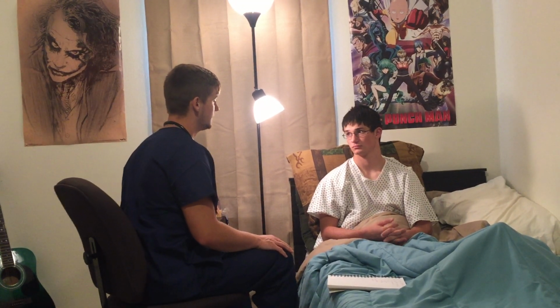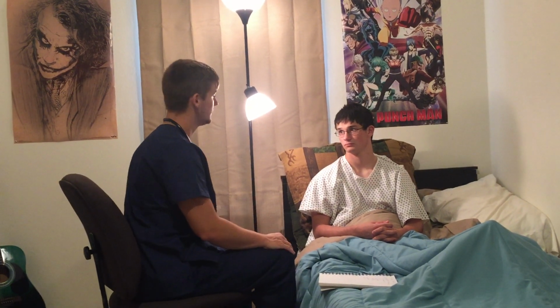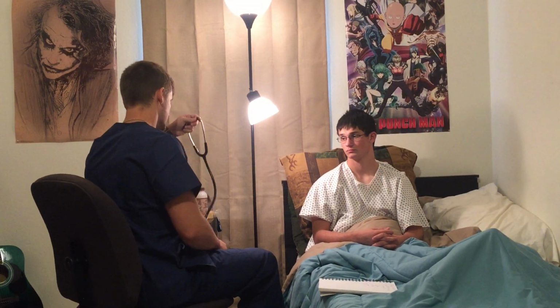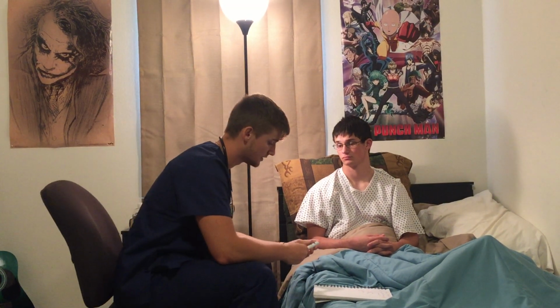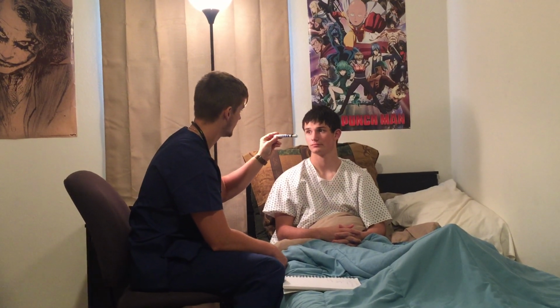We'll be looking at your head. So I'm going to assess the head for symmetry on both sides, which appears symmetrical, and his skin color is normal pink. I'm then going to test his eyes for accommodation to light and equal sizes and all that. So, I'll have you take your glasses off, please. All right. His pupils are equal size, both about a 5 on the pupil gauge.